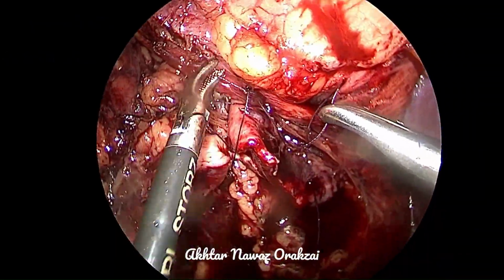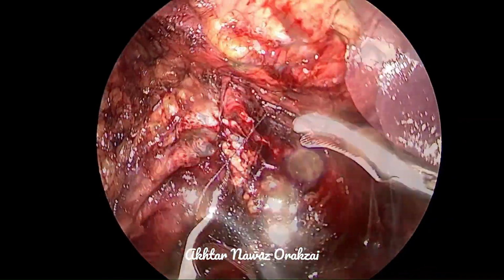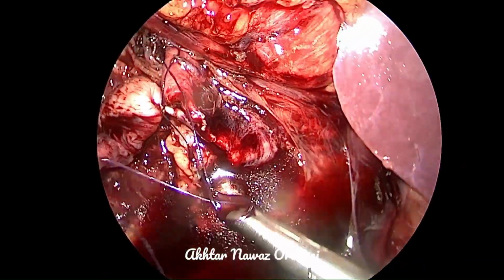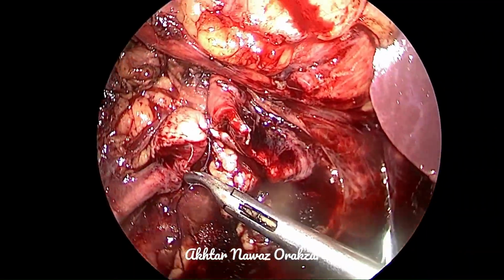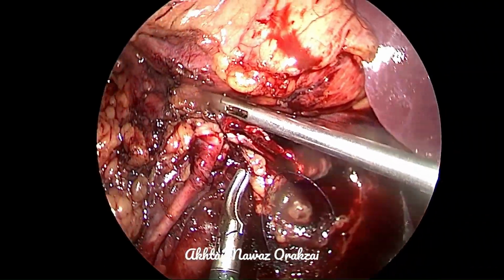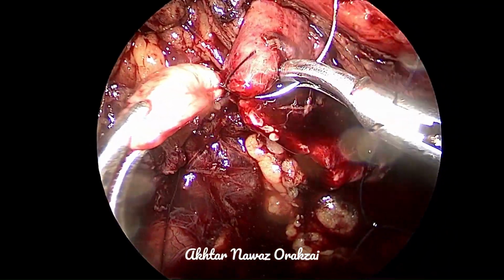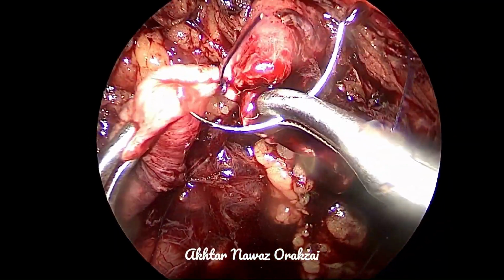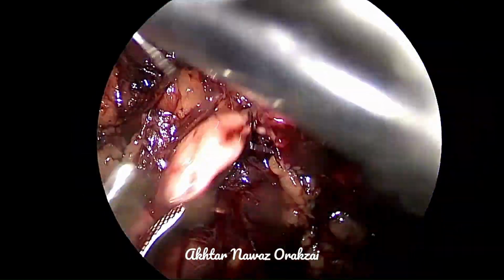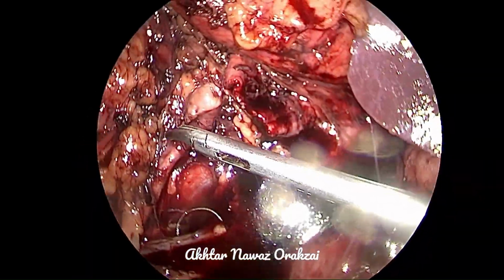So as far as the type of anastomosis, as I already mentioned, some people like interrupted anastomosis. However, I'm fond of doing continuous anastomosis. If it is interrupted, it has to be watertight. Interrupted sutures are better for maintaining the vascularity. However, it is difficult for them to be exactly watertight. So there is no harm.